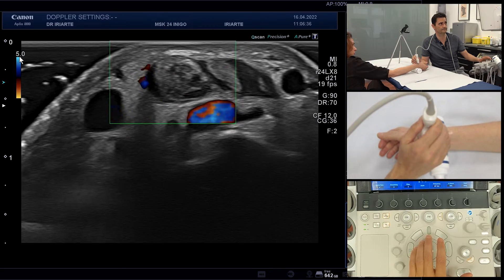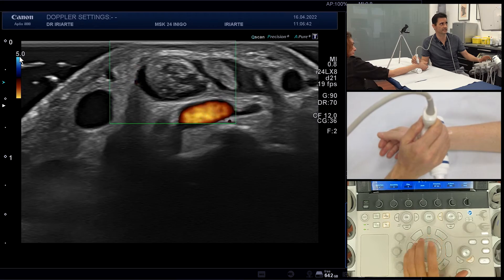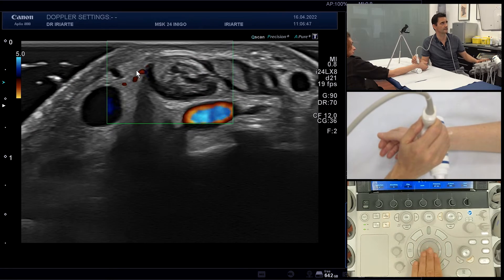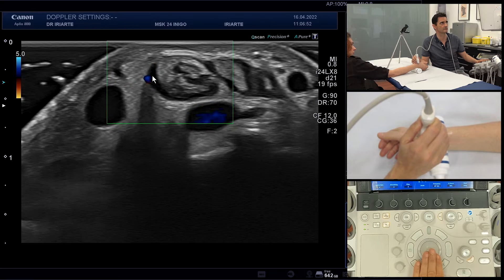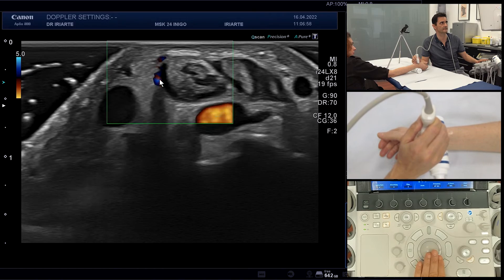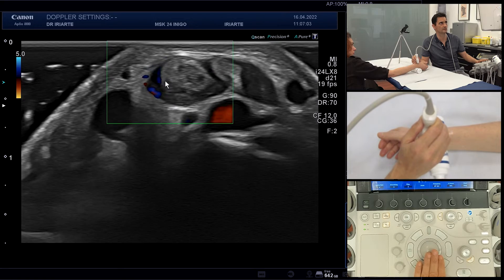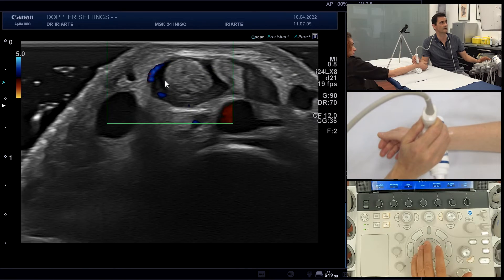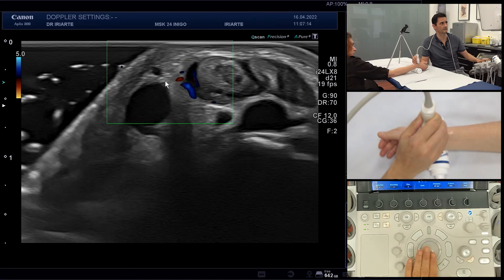Be careful not to push too much with the probe. If we push, you can see some vessels, but notice that as we release the pressure, we have a better view and better sensitivity of the Doppler. Don't push the probe too much because we are going to collapse the vessels and miss them.